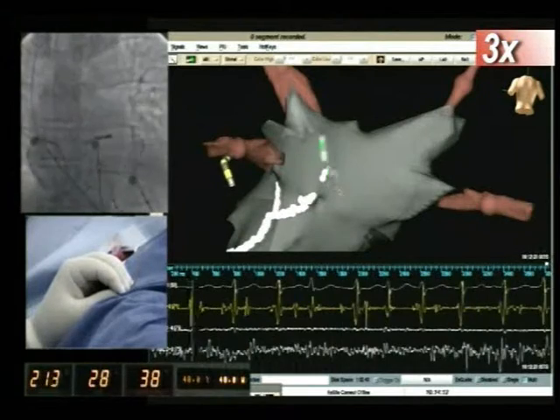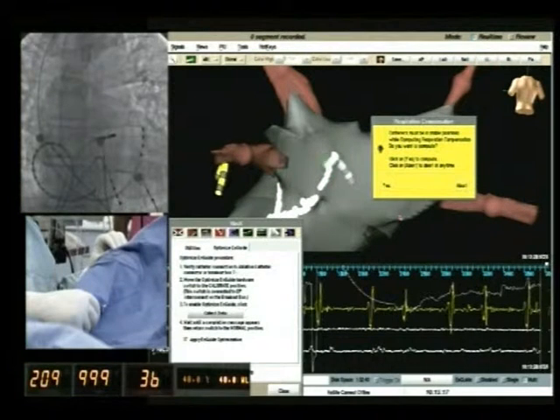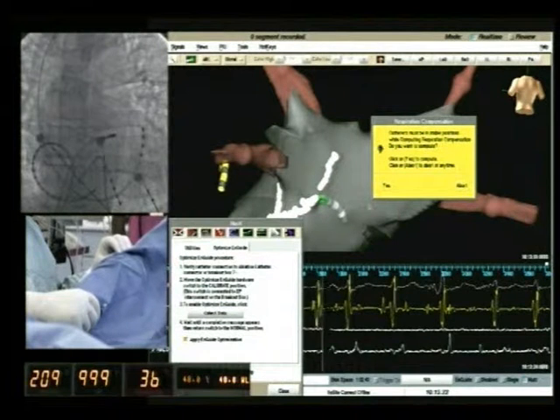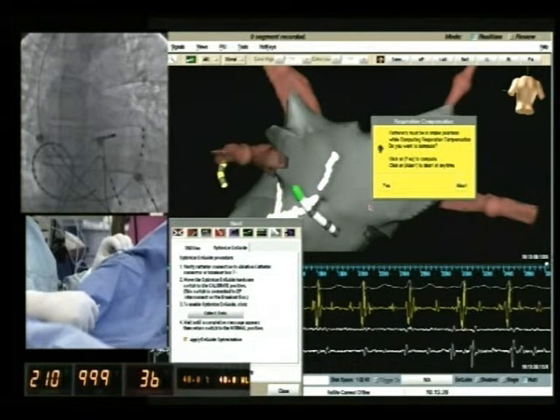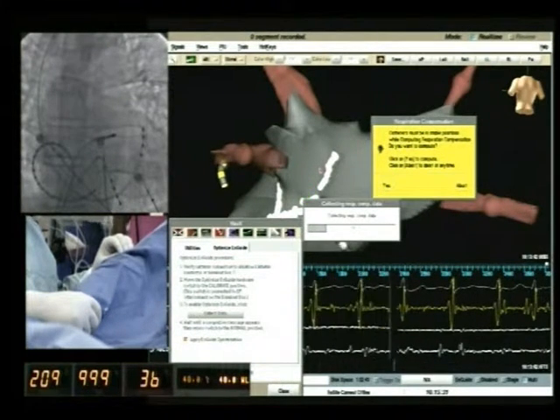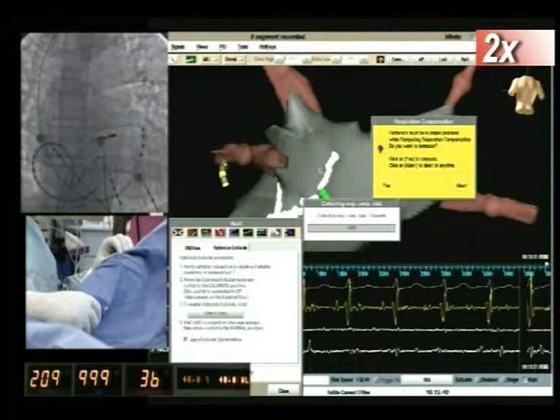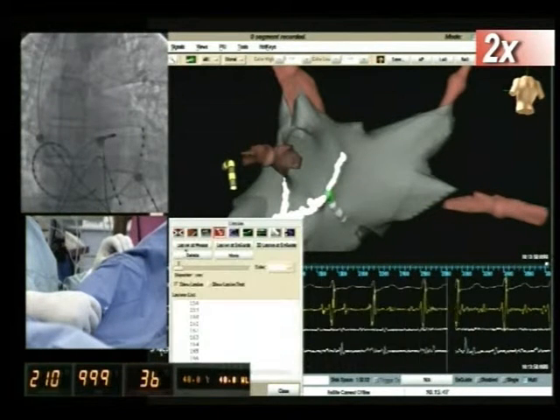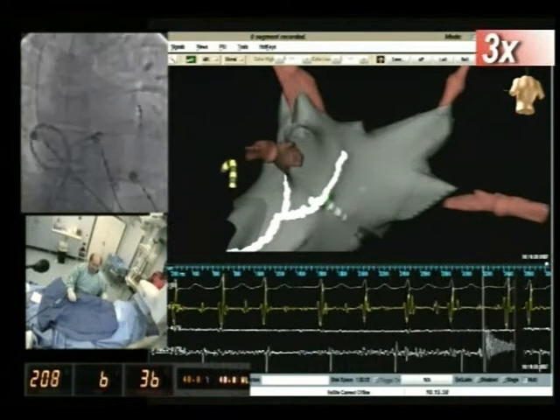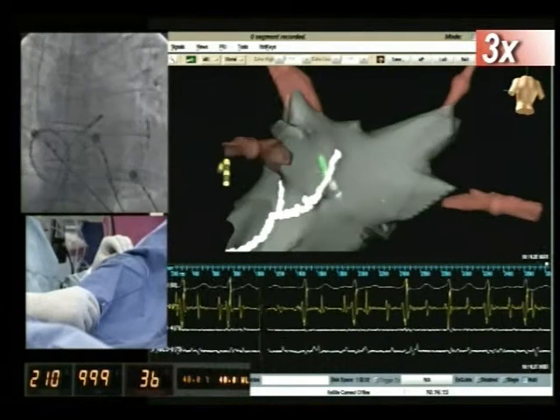When ablating the posterior wall, the occurrence of pain may cause the patient to move and to change his respiratory frequency, leading to catheter instability. In these cases, a new respiratory compensation is required. The respiratory compensation button is pushed and the yellow window appears on the screen, allowing to begin respiratory data collection. Data are being acquired in a few seconds. One of the advantages of the NAVX system is that patient movements during the procedure don't affect the reconstruction of the map, since the reference catheter moves equally to the patches attached to the patient's body.